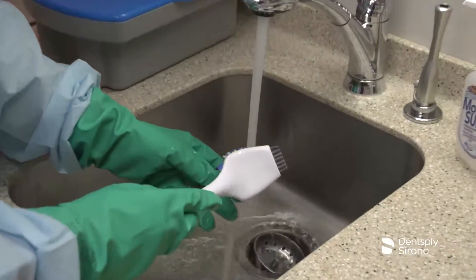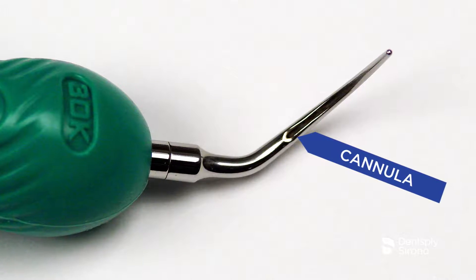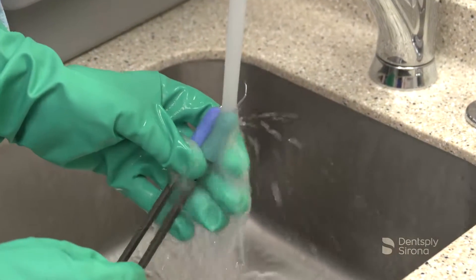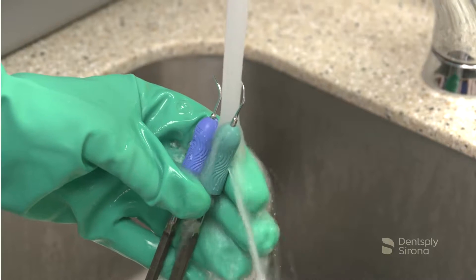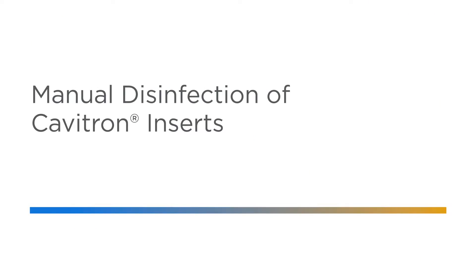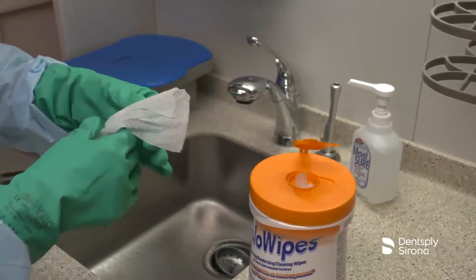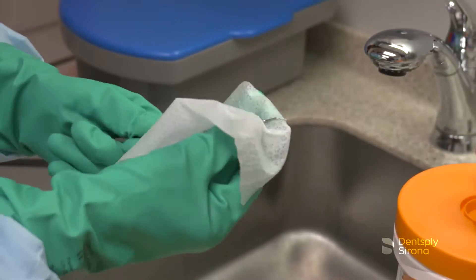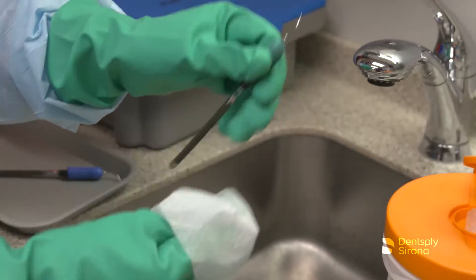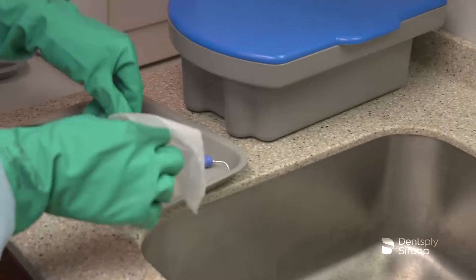When manually cleaning Cavitron inserts, pay particular attention to the holes and cannulas to remove debris. Rinse under running water for 30 seconds to remove the cleaning agent. A disposable syringe may be used to rinse the holes or cannulas. After manually cleaning Cavitron inserts, a disinfection step of the device is recommended. Thoroughly wipe all insert surfaces with a disposable wipe in combination with a bactericidal, viricidal, or fungicidal instrument disinfection solution, observing concentration rates and contact times.